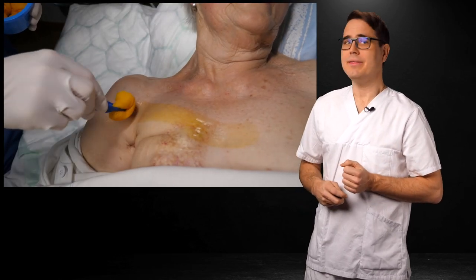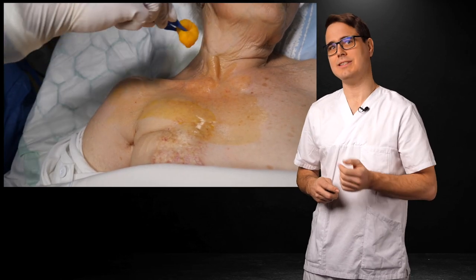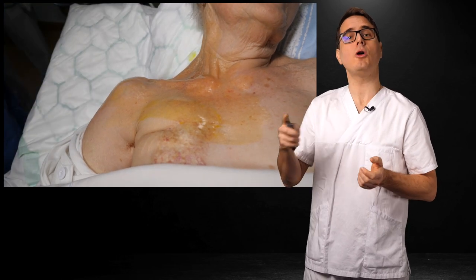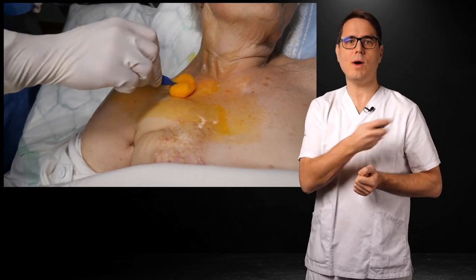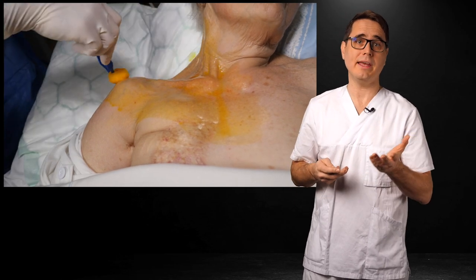Next, prep the skin while the patient turns his or her head to the contralateral side. Start with a large area and make it smaller with each pass. What you want to avoid is making all this effort and then taking a last swipe from the outer perimeter to your puncture site, potentially pulling in contamination. This is not sterile until it's dry, and the drapes won't stick to wet skin.